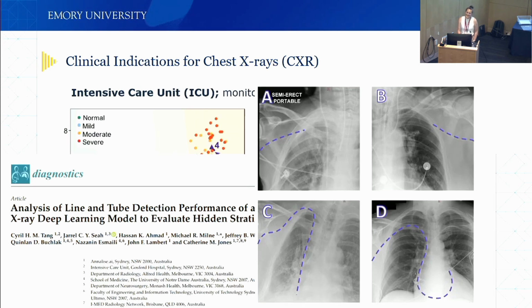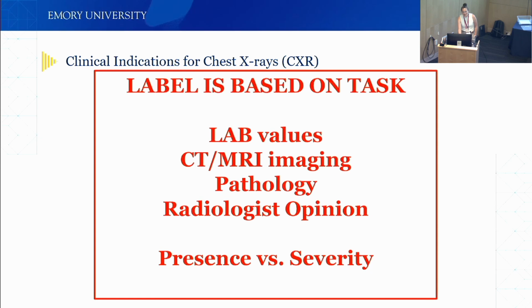Outside. Okay. We're more than happy to discuss them, but I don't have a lot of examples of them. So it depends which label you use, if you want to do presence or severity. Radiologist opinion, we've done studies on it. There's a lot of variability in there.